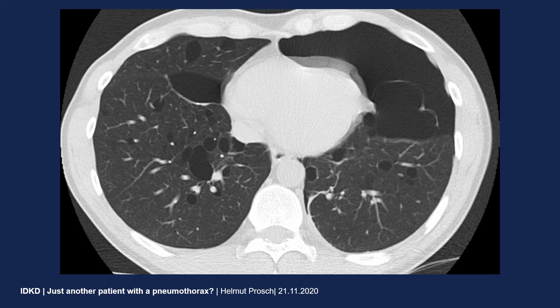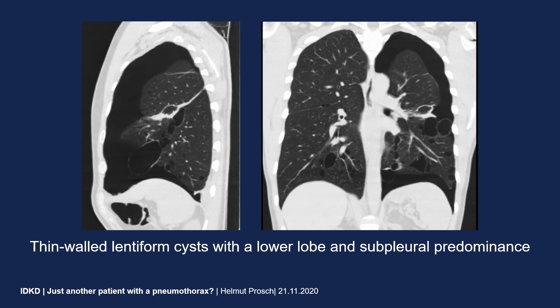Whenever you are dealing with a diffuse parenchymal lung disease, it's always important to look at the distribution. By looking at these coronal and sagittal displays, you will appreciate that there is a clear lower lobe predominance on both sides. There are some more cysts on the left side than on the right side, but these cysts are primarily located in the lower lobes. Most of these cysts are located close to the pleura, and many of them show a lentiform shape.